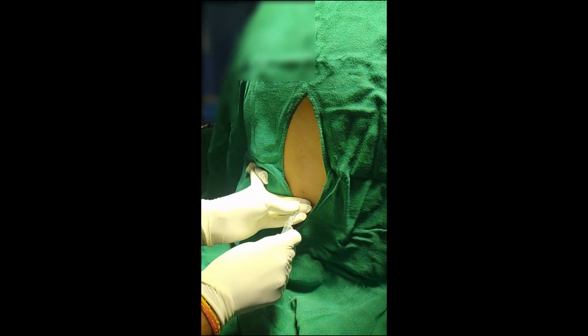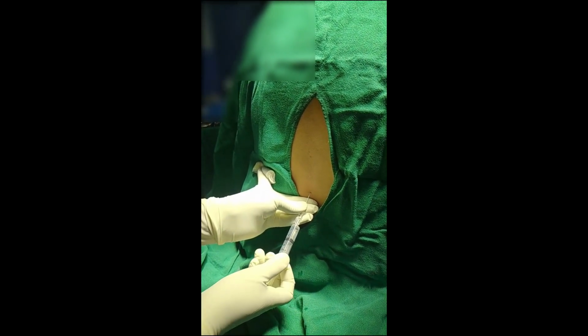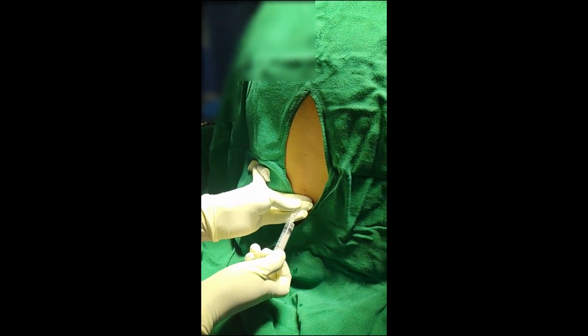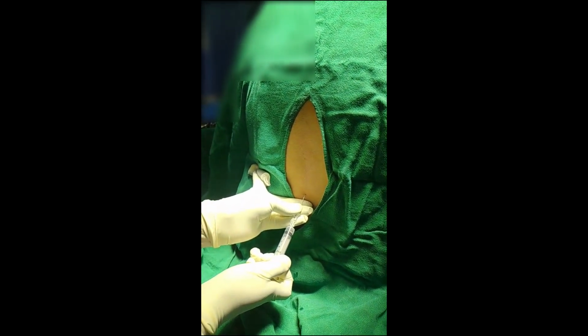Yeah. Now connect the syringe with the drug. Aspirate it slowly and inject the drug. Go slowly. Now aspirate it more and inject all the drug.